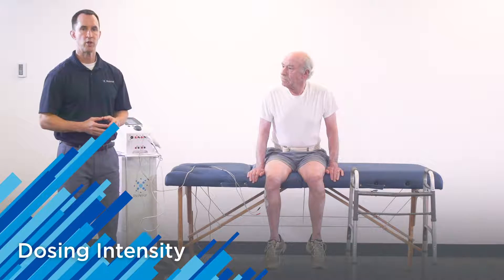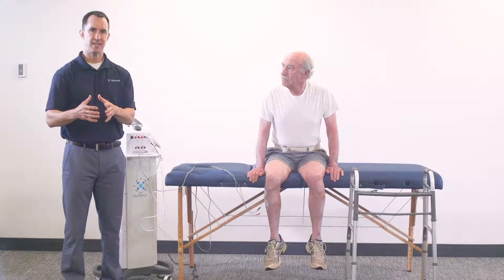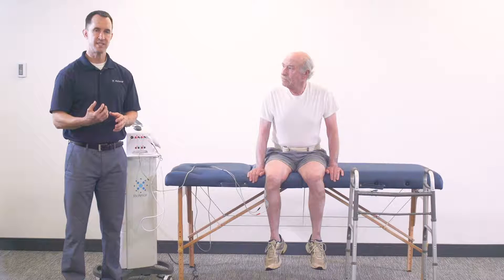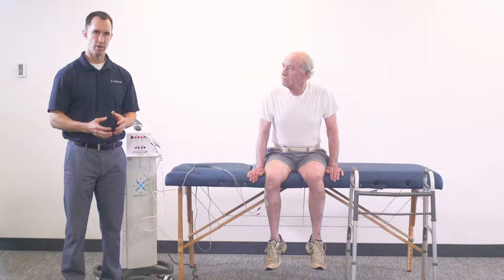We're going to show you just a couple of approaches you can use. When dosing the intensity, you want to make sure you're increasing the intensity to a strong submaximal contraction to facilitate ankle dorsiflexion with the stimulation.